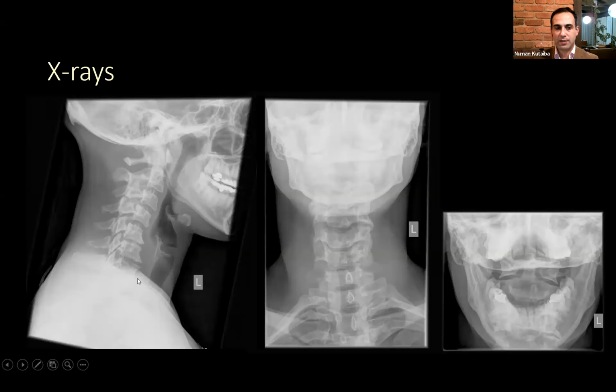In this case, this is an elderly patient. You can already see some degenerative changes in the lower cervical spine. There are some osteophytic changes and narrowing of the intervertebral disc space, and straightening of the cervical spine. Normally it has a lordotic alignment, which means it's slightly convex anterior, towards the anterior part of the patient.